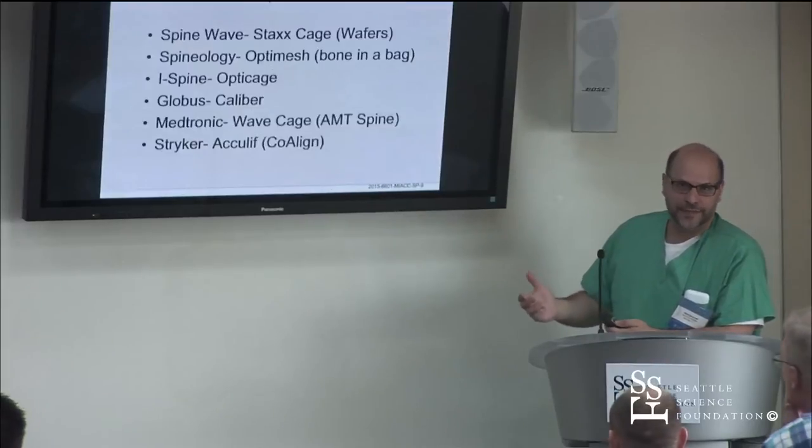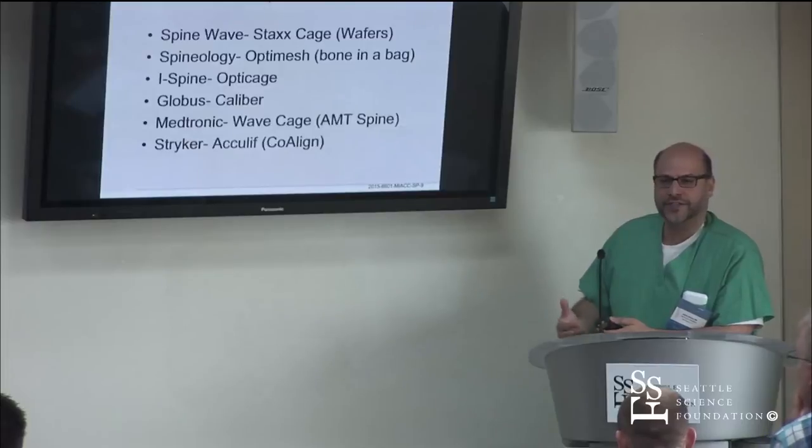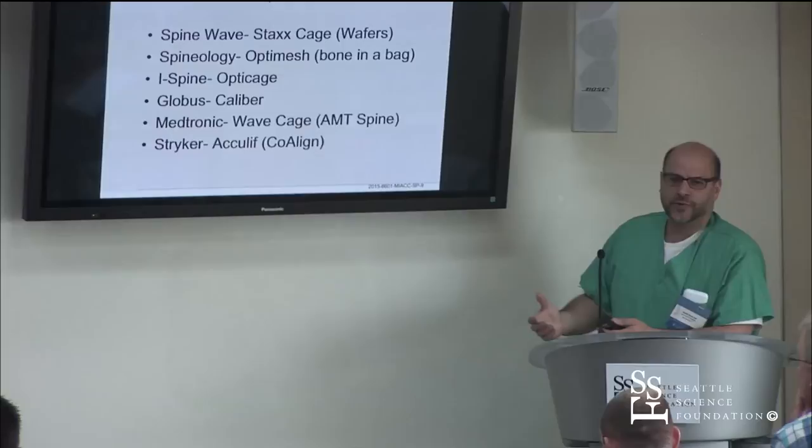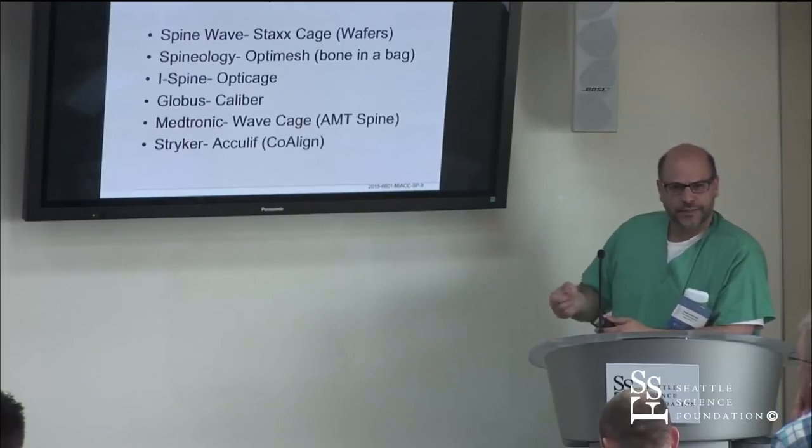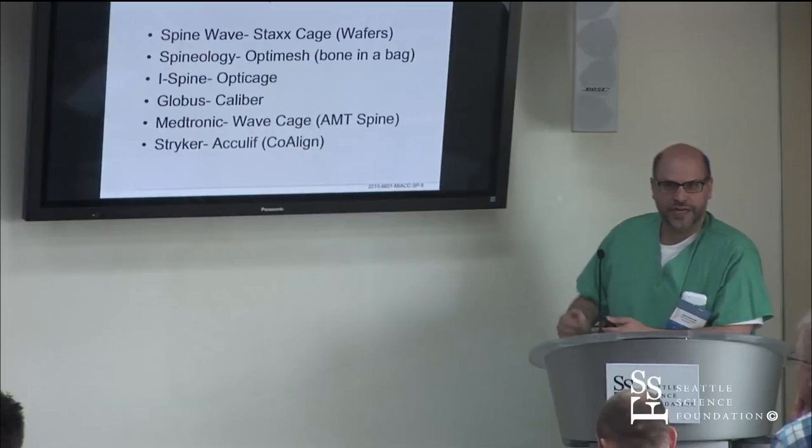All right, so here's some of the competitors. The wafers, the Spine Wave stacks. I think that was one of the first ones. Correct me if I'm wrong. No chamber at all. Some surgeons didn't like that. They didn't like to just, you know, put a hunk of plastic in there with no chamber.